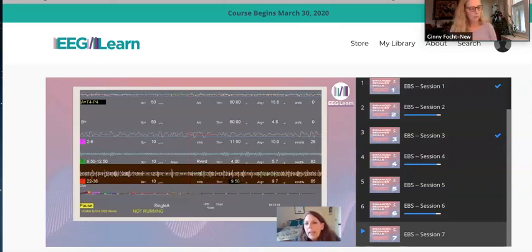This is another T4 minus P4 hookup. And here, both the inhibits are similar. They're higher than our reward. And I know, with our little mantra, high before low, fast before slow, back before front, right?